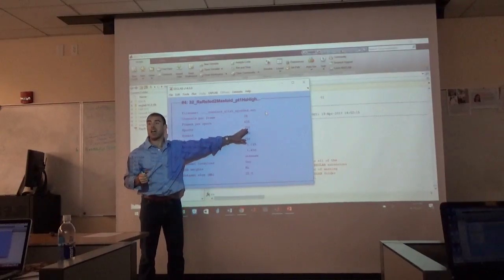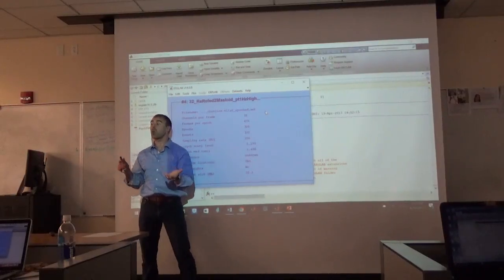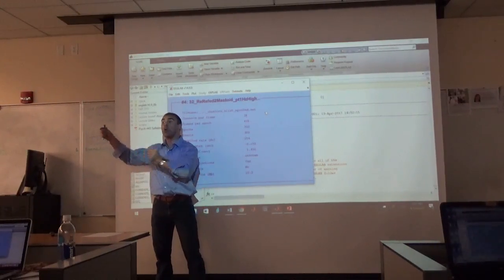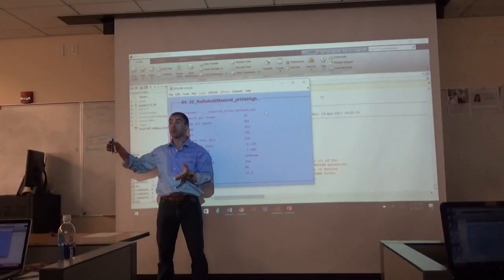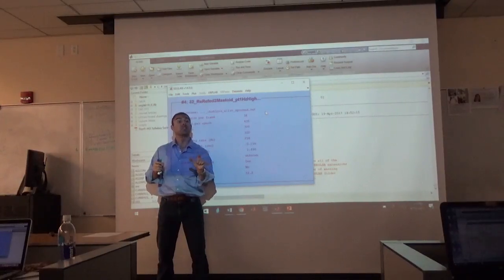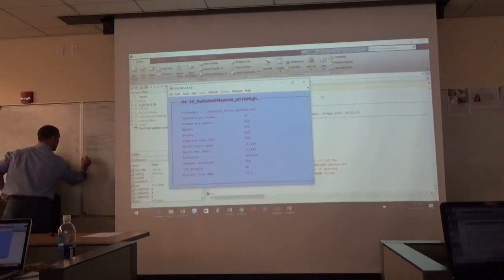Okay, so now that we have our windows, what can we do now? What did we start this class today talking about doing? Looking at artifacts, right? One way that you can get around it when people blink is to tell them, don't blink during this period of time, but it's okay to blink in this other time. Well, that other time when it's okay to blink, for example, we just chopped all that out, because that's not in our window. So now, we're going to look to see what artifacts are left in the windows that we do need. Okay? So, let me just add our next step that we wrote on here. Number 6 was events list. 7, we epoch the data, right?